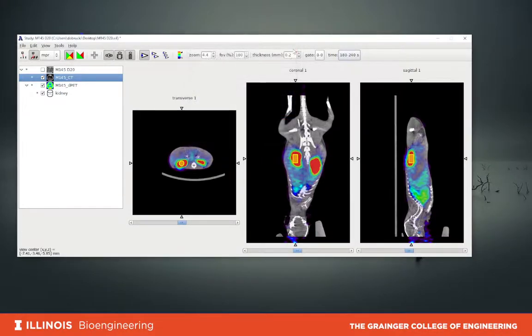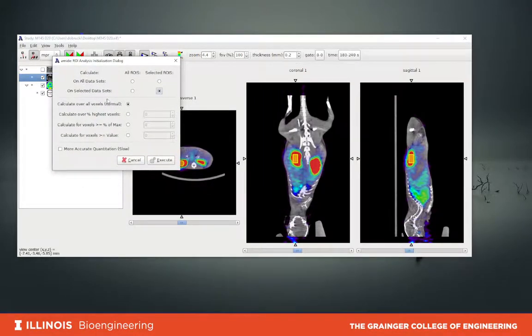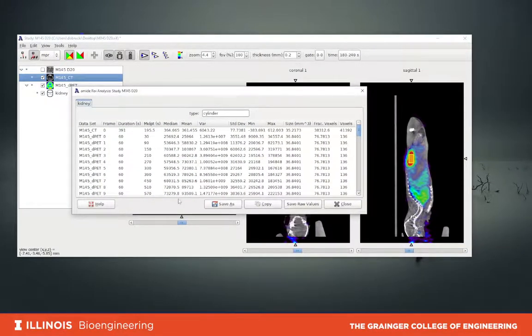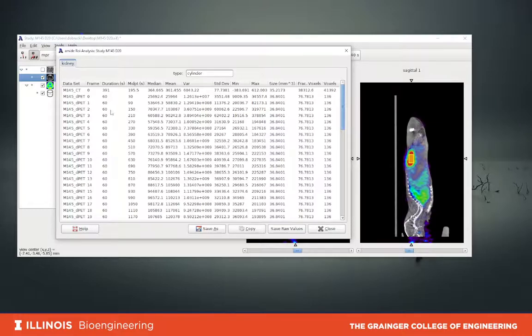Let's perform the actual analysis. We go to Tools and select 'Calculate ROI Statistics'. When we click that menu option, we can choose selected regions of interest on selected datasets, or select all regions of interest and all datasets — this will be the safe choice. We'll calculate over all voxels. I prefer to click 'more accurate quantification', which will be a little bit slower, but with modern computers it will be almost immediate. When we execute, within a second or so we get the table with the calculations.